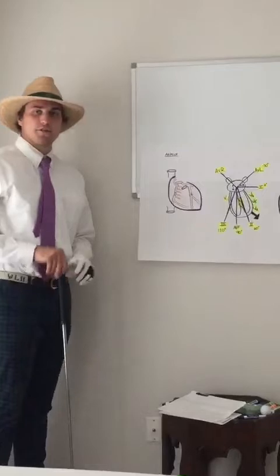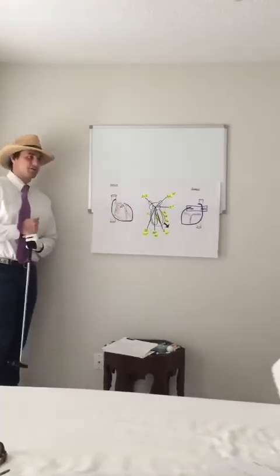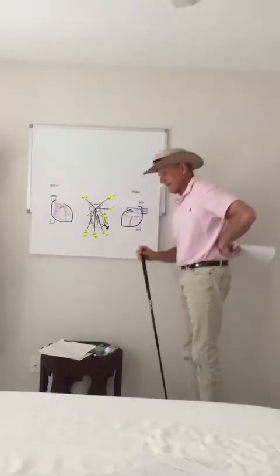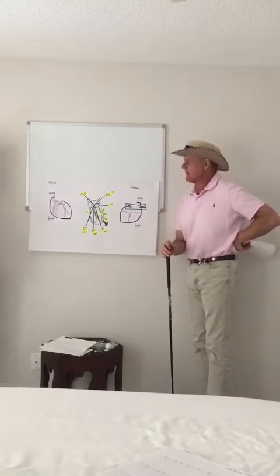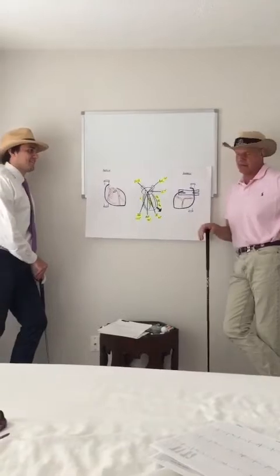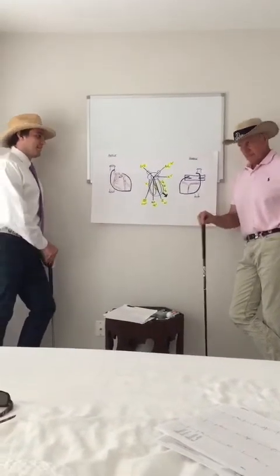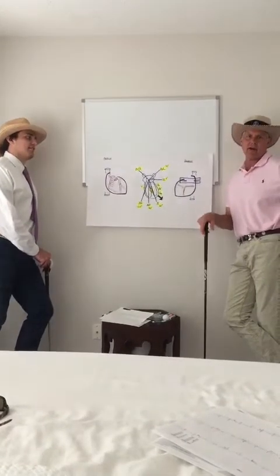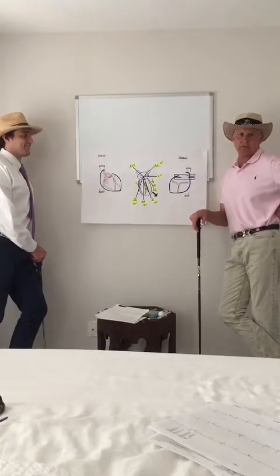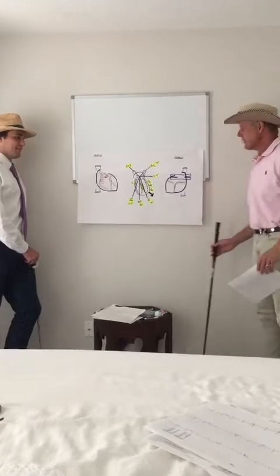Dad, you're going to come show us about the world famous posterior wall infarct, which is pretty scary. Well, what you did was kind of like hitting an 8-iron 170 yards on a par 3 and getting in with about 10 feet, probably a 2 or 3 putt, depending on your day. What I'm getting ready to show you, diagnosing posterior infarcts, is a little bit hard. It's like hitting a driver off the deck. You get about 280, trying to get on the green in 2 on a par 5, you're down, you've got a lot of money on the bet. So we're going to talk about posterior infarcts.